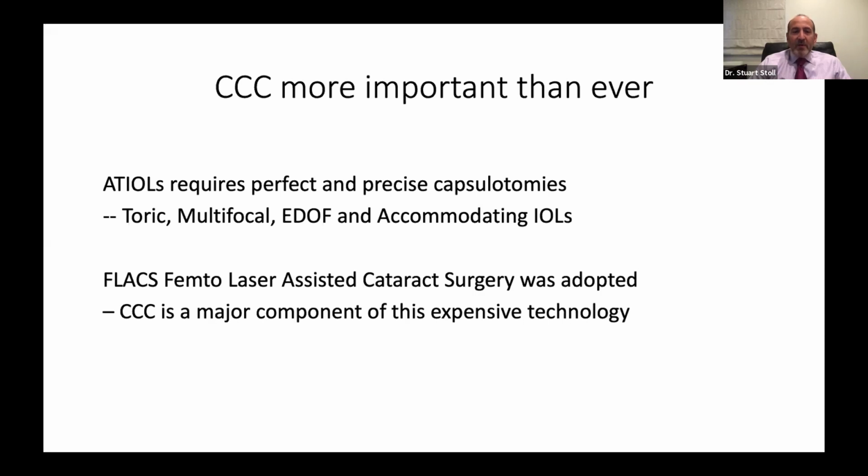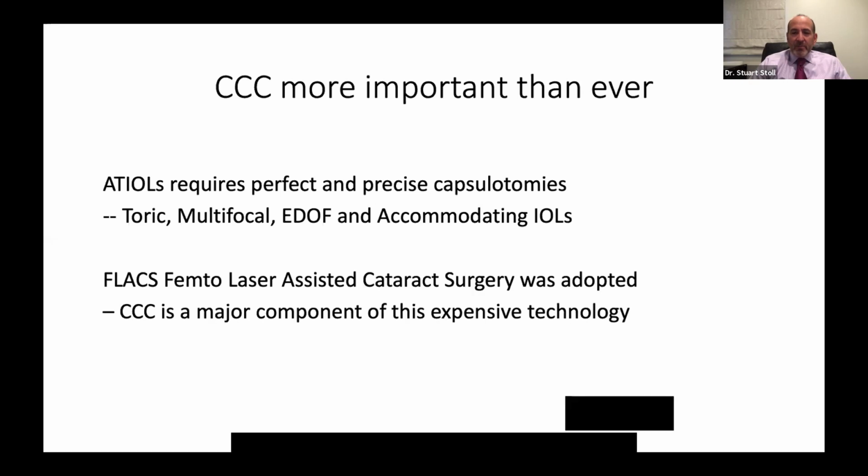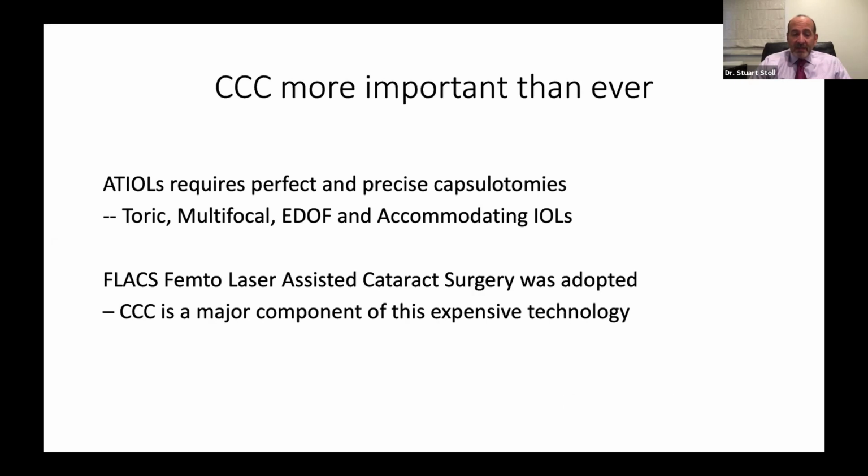Even if you have access to a femto laser for cataract, you have to have your skills down. There are going to be times when you can't use those lasers, pupils too small, or many of us are just not going to ever have access to those. Or in the beginning, I was a very early adopter of FLACS, and it was actually more challenging doing surgery with the laser because we'd have tags and things where you pull on the capsule wrong and you'd have a weak spot and it would run out. That's largely been resolved, but as an early adopter, we had to know how to manage those issues.